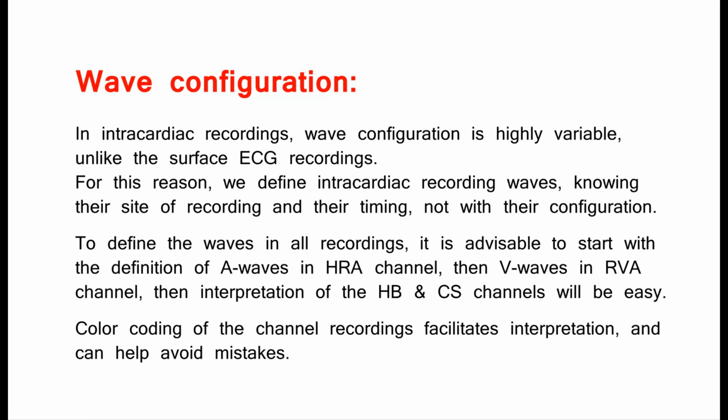To define the waves in all recordings, it is advisable to start with the definition of A waves in HRA channel, then V waves in RVA channel, then interpretation of the HB and CS channels will be easy. Color coding of the channel recordings facilitates interpretation, and can help avoid mistakes.